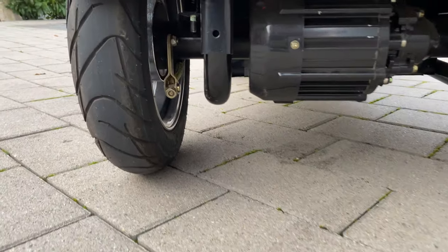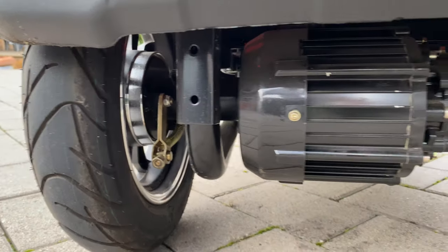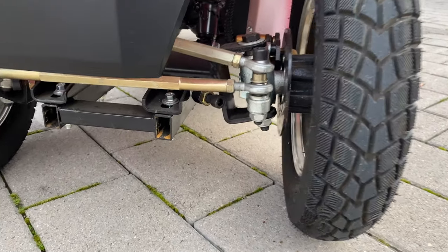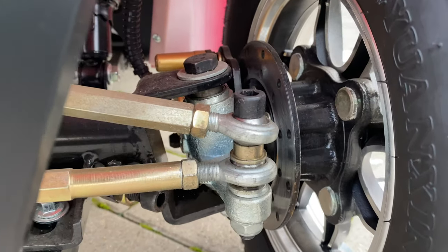A brief view from below shows the drum brakes and the powerful 1,000-watt motor. The hydraulic disc brakes and the tie rod suspension are clearly visible in the front.